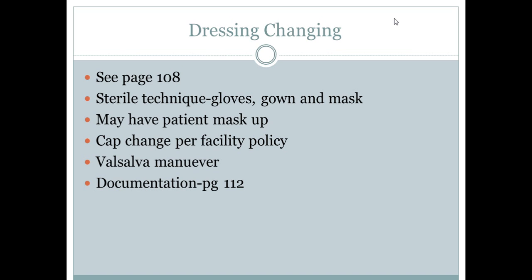Kinks can happen with the catheter underneath the skin. They can find these through x-ray. So again, if you go to flush, it's not uncommon, let's say if you have a triple lumen, for one of the lumens to not flush well, or it is common for them to stop giving you blood return. So let's say the RN is drawing blood. It is important that you document when this happens. And the lumens are going to be different colored, so you can say red, brown, or blue. You'll also notice in the documentation that an RN will document, or should be documenting, which lumen she drew blood out of if there's multiple lumens.